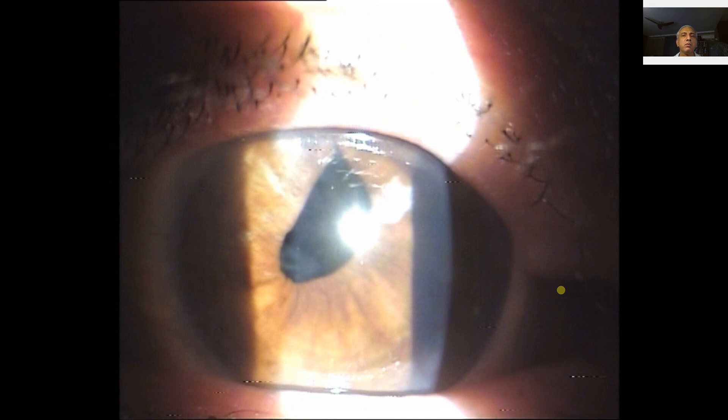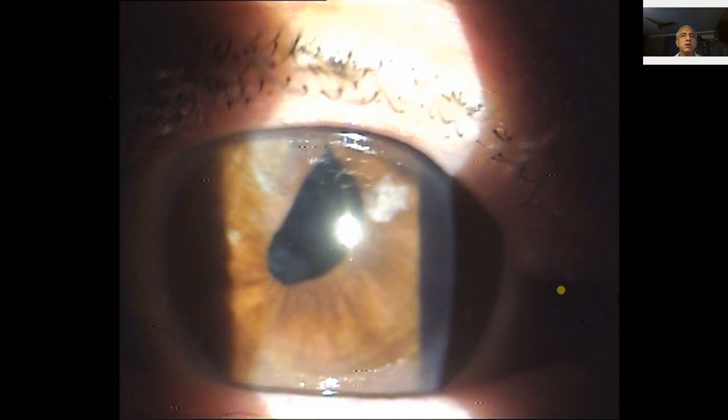Here you can see diffuse illumination of the anterior segment. Increasing the slit lamp magnification, you can see the anterior chamber is deep. The distance between the slit and the iris is significant. The pupil is drawn upward in this patient with atrophy of the iris in these areas.